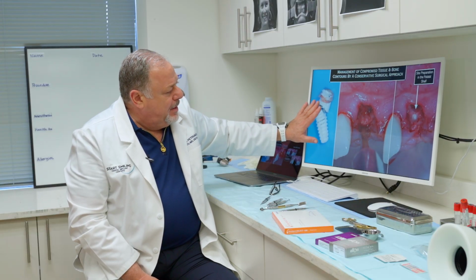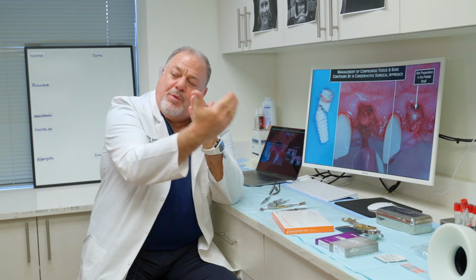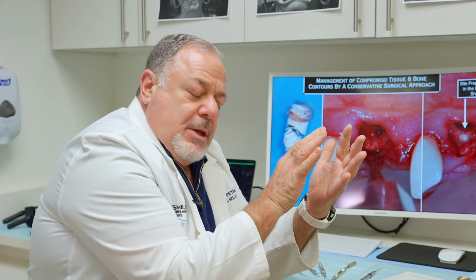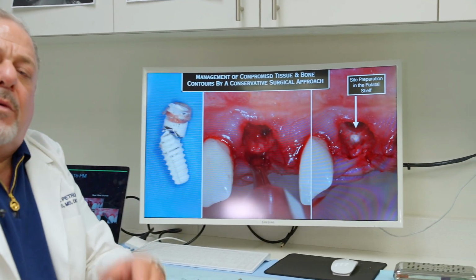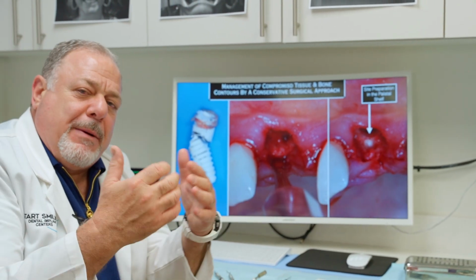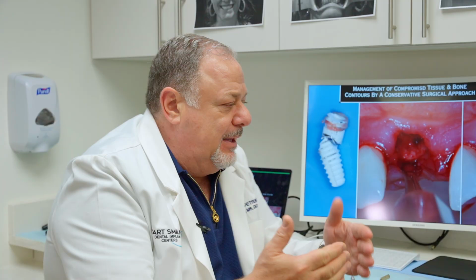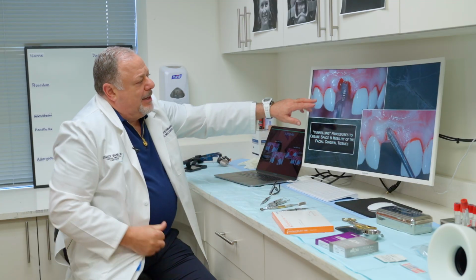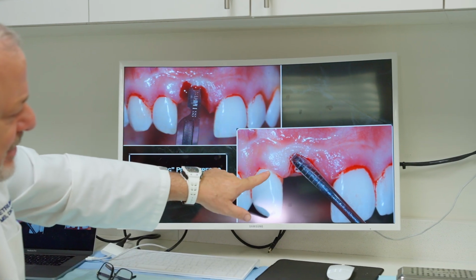You can see the hole here. We have this all loose here. But remember, that implant was forward from where the trunk of bone was. So if I can go in here and make a little notch on the palatal shelf, well, now I've got a good amount of bone that I can use for my site preparation, and I can start to increase the diameter of the implant itself. So as I go to this, now we're just going back to show you again. Here's that 15C, so I'm making my incisions this way. And then here are the tunnel instruments.